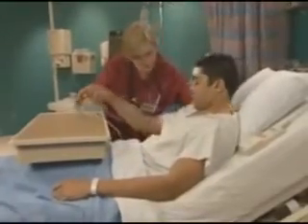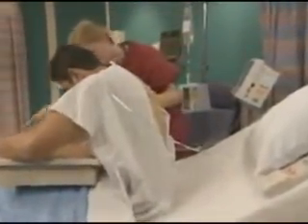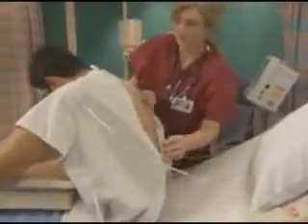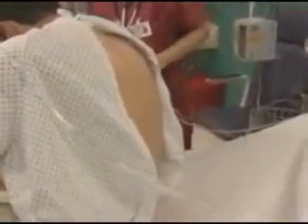Help the patient into an appropriate position. If he can tolerate sitting upright, have him lean over a bedside table to accommodate a tube in the 4th or 5th intercostal space, usually lateral to the nipple line. Otherwise, help him into the lateral supine position with the affected side up.